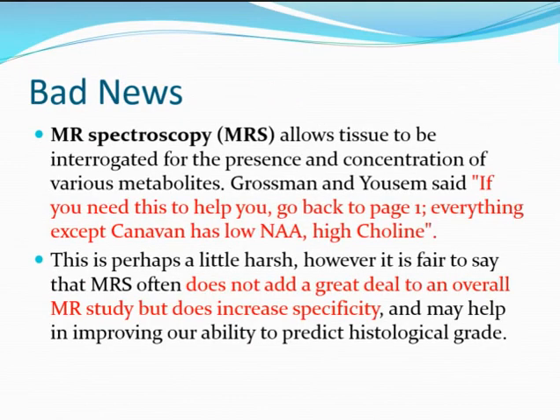So, we have some bad news here. MR spectroscopy allows the tissue to be interrogated for the presence and concentration of various metabolites, but Grossman and Yousem said, if you need this to help you, go back to page 1. Everything except Canavan has low NAA and high choline. All diseases except Canavan disease all have low NAA and high choline. So if you need spectroscopy to make a diagnosis, you don't know anything. You have to go back to the first page, okay?